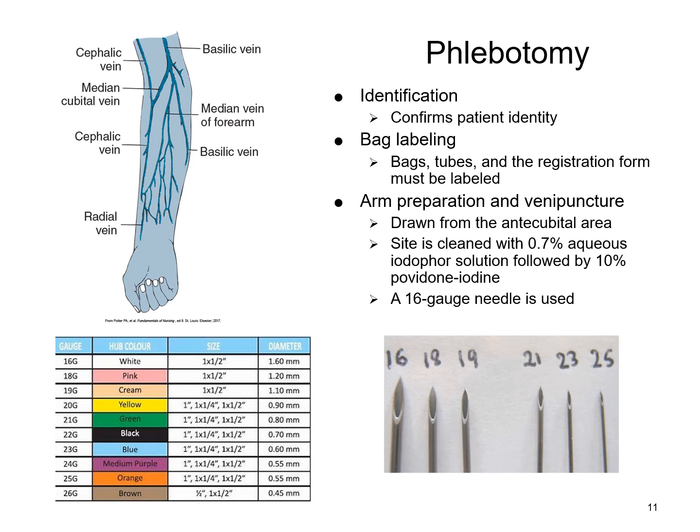Now, the needle gauge is 16 gauge, so it's a pretty large needle that is used for a typical donation. Most of your straight needles are going to be this green needle, that's a 21 gauge needle. So you can see the size of the 21 gauge needle here, for the typical blood draws that you will perform for blood testing.